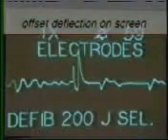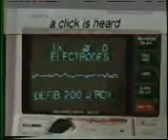Other indicators the operator can use to determine that the defibrillator has discharged into the patient are: an offset deflection will appear on the screen, a click is heard on discharge, and a defibrillation message is printed on the paper. After discharge, immediately push the Analyze button again.